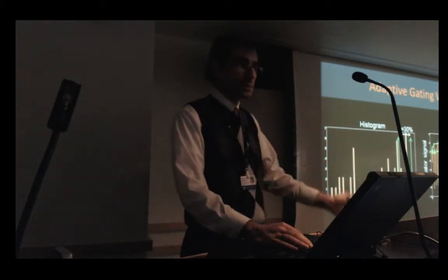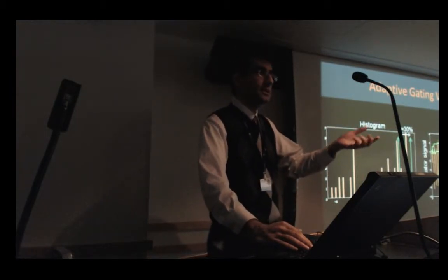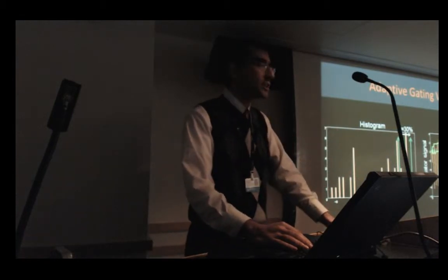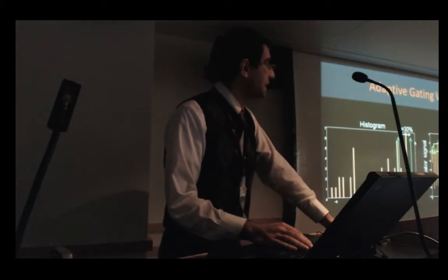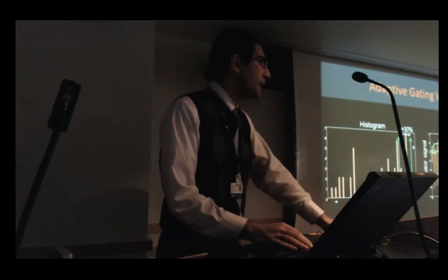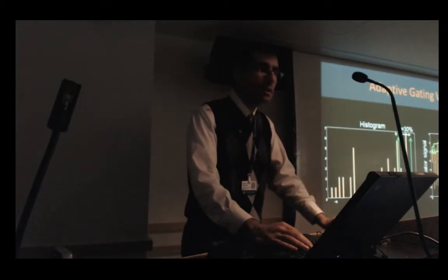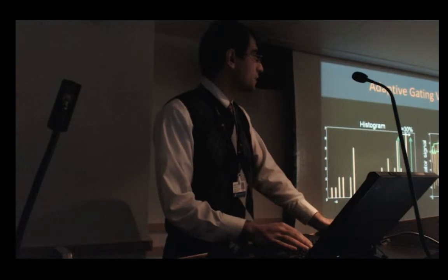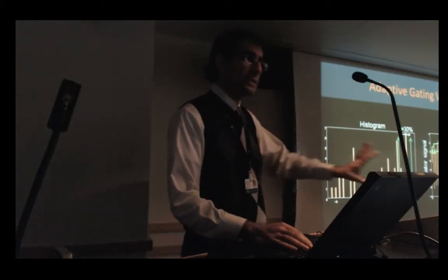One way would be to use an adaptive gating window. In the images that I showed you, we used a constant 5 millimeter gating window to suppress the respiratory motion of the heart in the center of K-space region. 5 millimeter could still be long, right? Because depending on how heavy a breather you are, if you breathe within 5 millimeter, you are not gating at all, right? So I'm not suppressing respiratory motion at all. I cannot reduce the gating window to 1 millimeter because the scan may not finish due to the very small drift, then I cannot finish the scan.